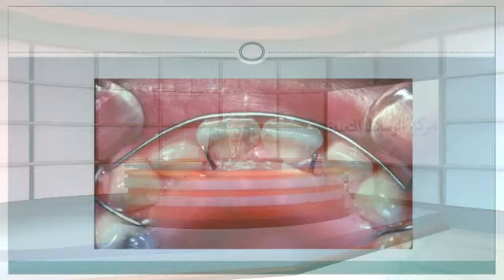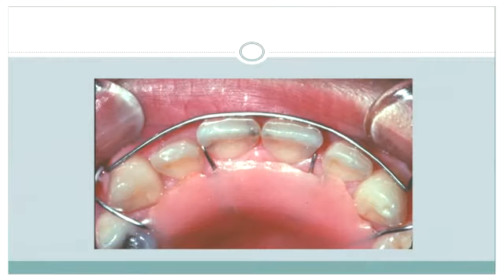Therefore, today we need to focus on removable appliances. Removable appliances can be removed from the mouth by the patient. A removable appliance consists of different components. Some components move the teeth, while other components provide stability of the appliance in the oral cavity, like the base plate.